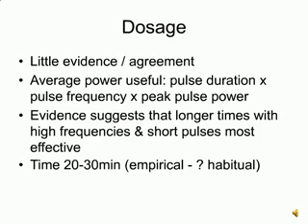The evidence does seem to suggest that treatment for longer time periods using higher frequencies and short pulses might be more effective. The normal treatment time recommended is between 20 to 30 minutes, but there seems to be no clear rationale for this, except that it fits quite well with the time that patients often have for a treatment session. It may well be that other treatment times might be more effective, but often the pragmatic decision in research trials has been to investigate commonly used treatment times such as this.